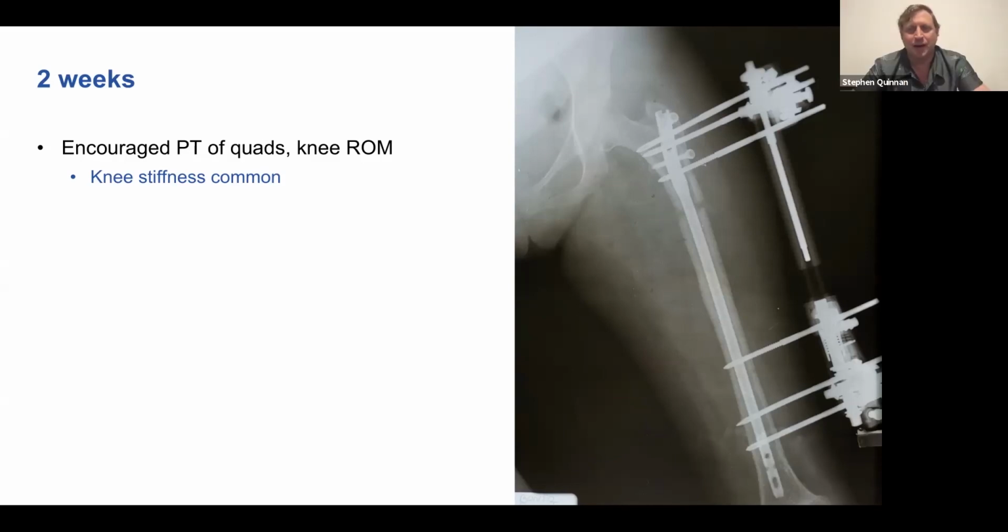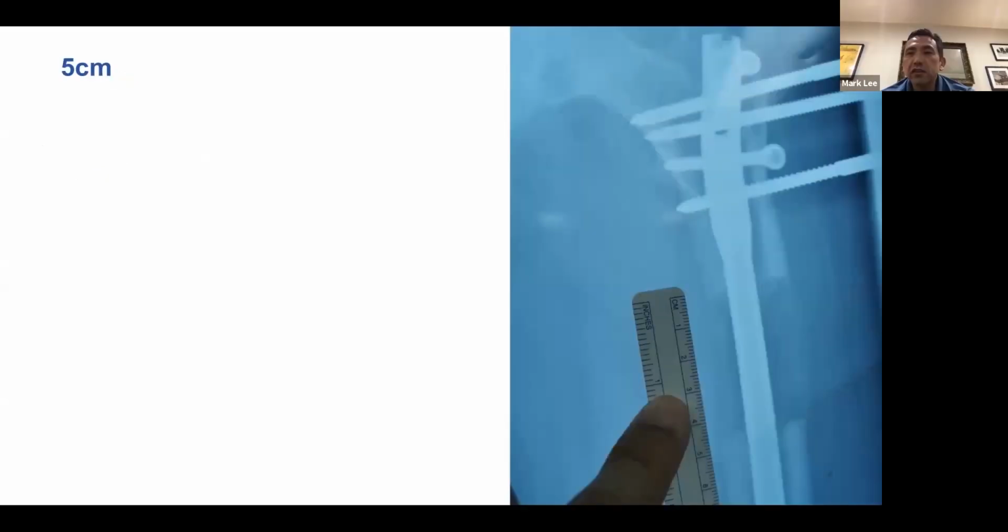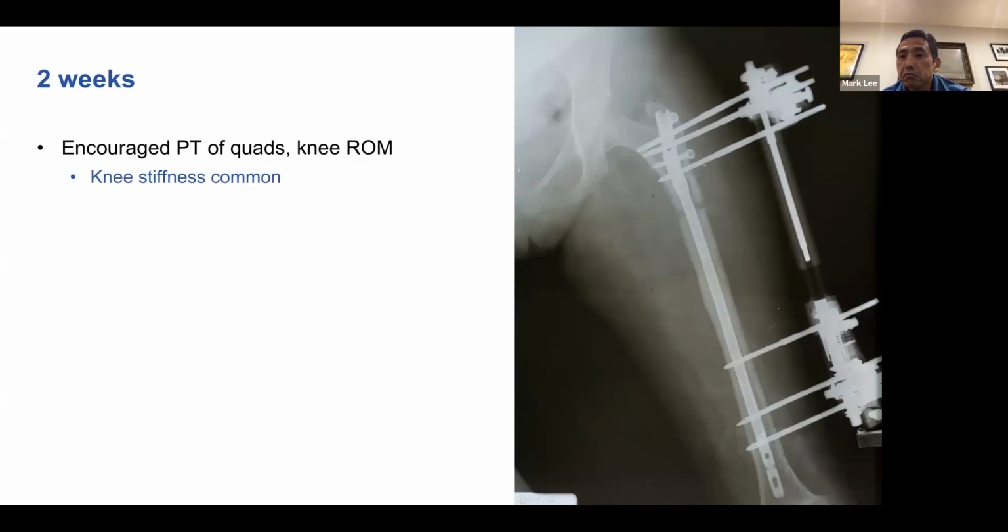Totally agree. That was perfect. That's exactly what I would do. Cannulated drill. You start at the far sides of the bone and the pin goes in the middle. And the HA coated pins do matter. They matter a great deal in terms of protecting against infection if you have them available. What size pins? Are 5 millimeters good? Six. I think these are fives.